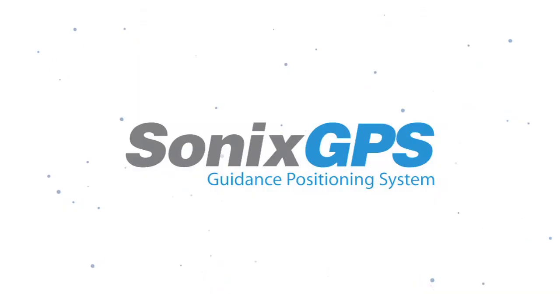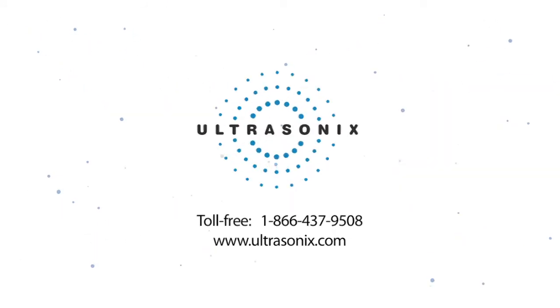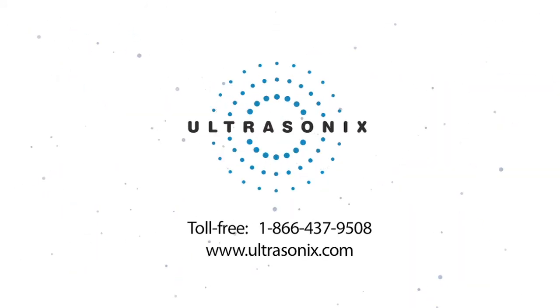This technology is only available from Ultrasonix, and we look forward to having you visit our website to learn more. ultrasonix.com — or call 866-437-9508.